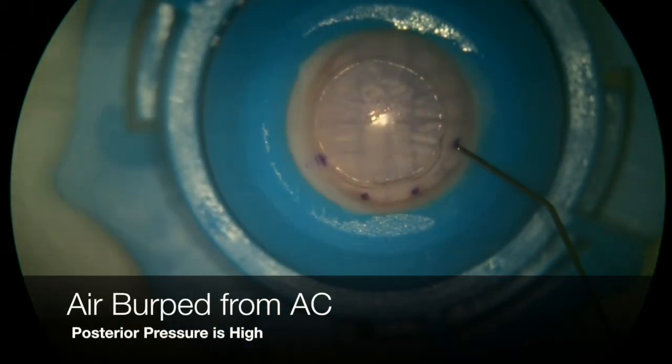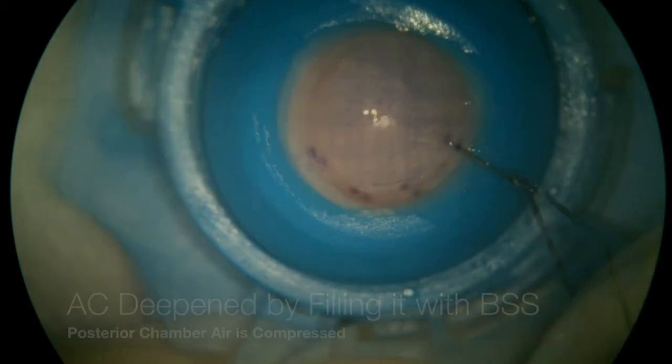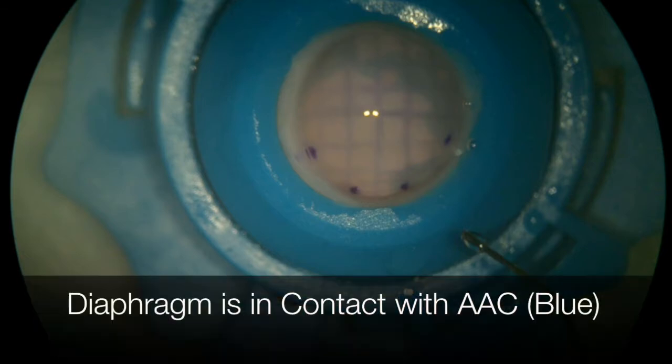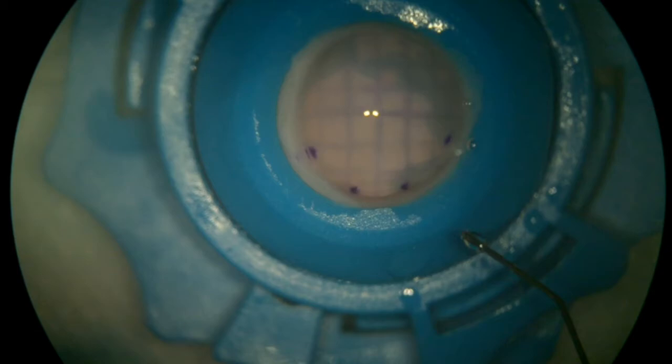With the anterior chamber now shallow but pressurized, the residual bubble can be burped from one of the paracentesis incisions. The anterior chamber can then be deepened again by injecting BSS through one of the paracentesis incisions. When this is done, the pressure of the anterior chamber exceeds the pressure of the posterior segment.